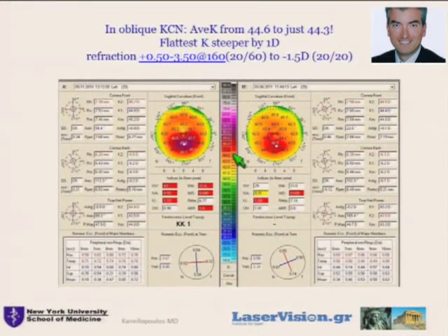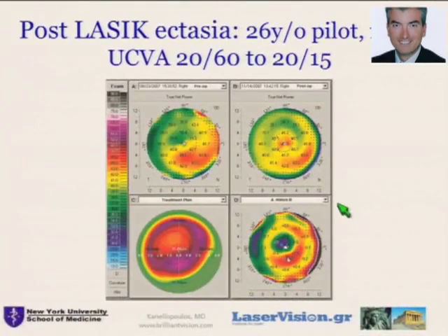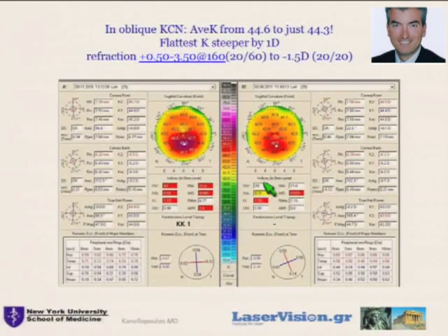This is a much nicer example here. You can see the Pentacam here picks up keratoconus 1 after the Athens protocol. This cornea is picked up as normal by the Pentacam. And just to go back for a second, I'd like to draw your attention. I propose this as a means to evaluate keratoconus and visual function, and not visual acuity and refraction.